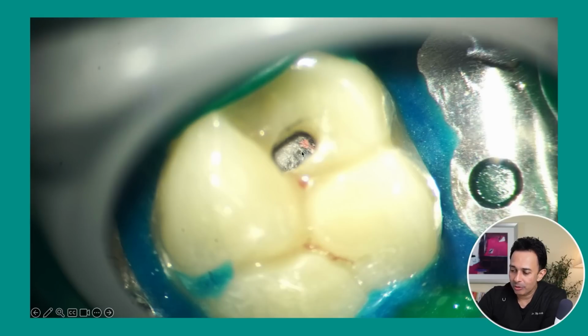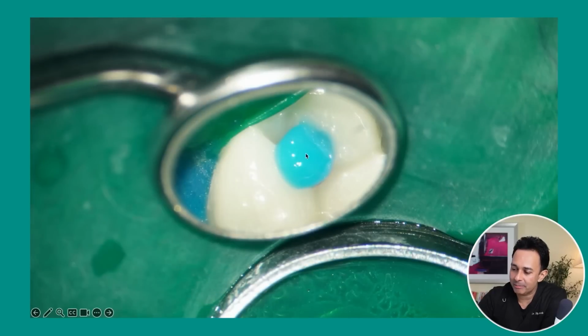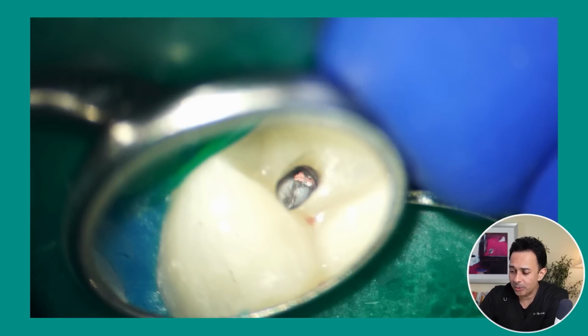But in the process of looking for the MB2, the pulpal floor often becomes clogged with debris, so it's not very clear. So what I like to do in these cases is apply a little bit of etchant, orthophosphoric acid, which we use for acid etching for restorative procedures. I fill that pulpal floor, then scrub it with some microbrush, rinse it out.